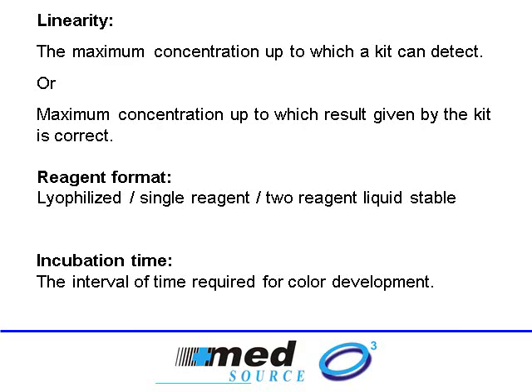The next feature that we need to talk about is incubation time. As we know from the previous presentations, especially for endpoint reactions, the reagent has to be incubated along with sample for a fixed amount of time. The lesser the time, the better it is, so that we can get results quicker.